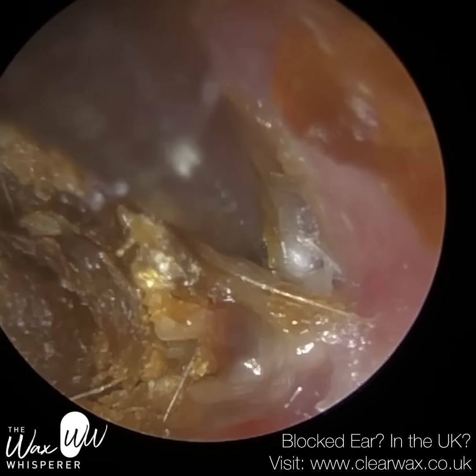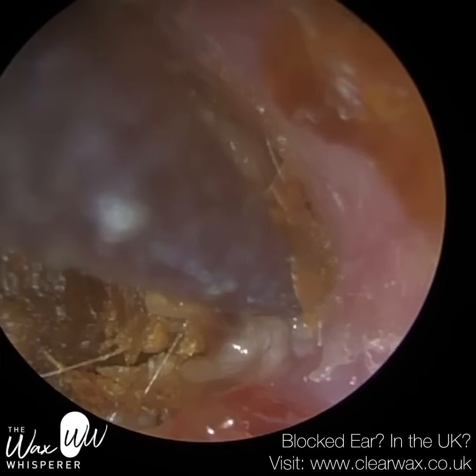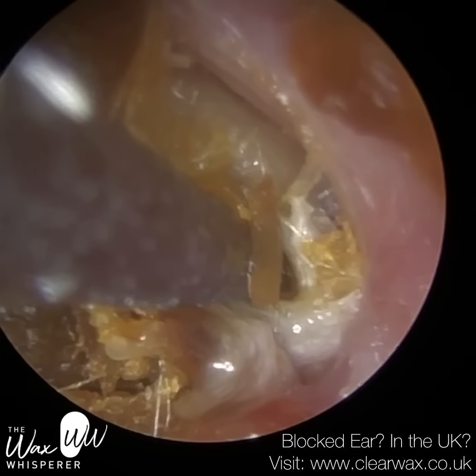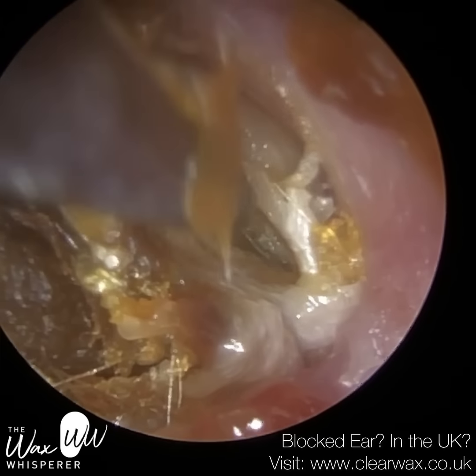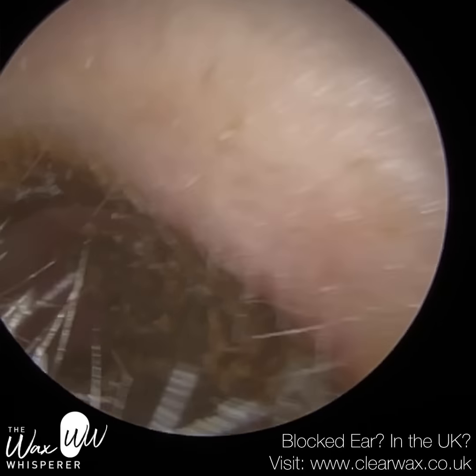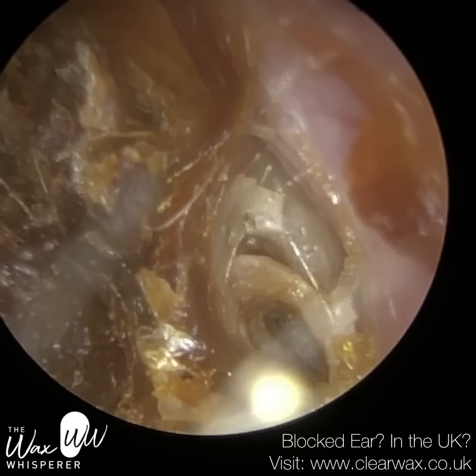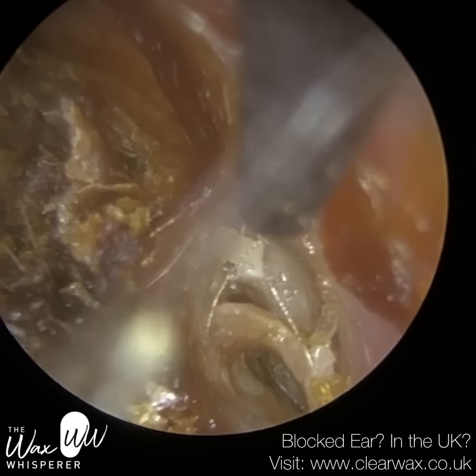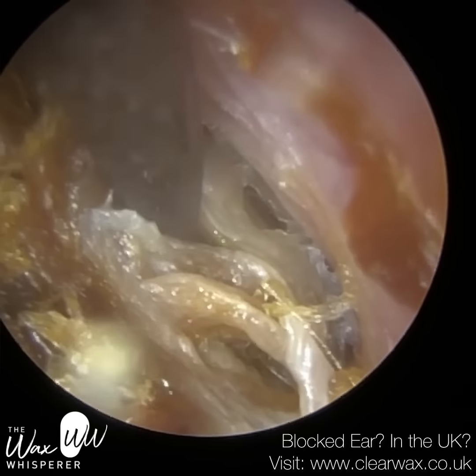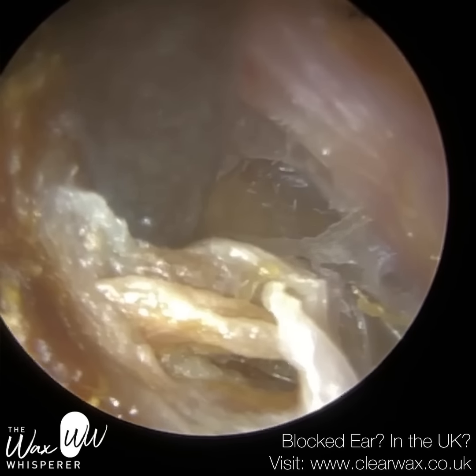So I'm gliding against the back and the floor of the ear canal actually, and you can see this silvery white peripheral matrix of the plug. This is very common with the Keratosis obturans. This is the most recent dead skin layer that hasn't oxidized. So generally, when you remove a Keratosis obturans, you get this peripheral white or silvery matrix of skin. And even now, I'm not fully aware of how big this widening of the ear canal is. It's only once I remove it that you really begin to appreciate it.